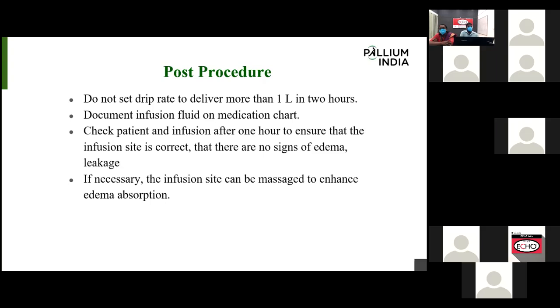Then after starting the infusion, we need to check the patient. After 1 hour, we strictly need to ensure that the area is correct, and check for any signs of edema or any fluid leakage on that area. Within 1 hour, we need to strictly ensure about that area.